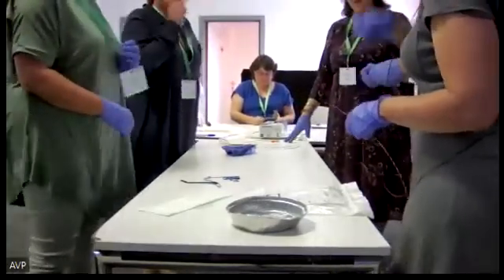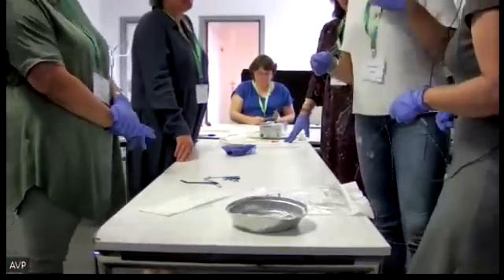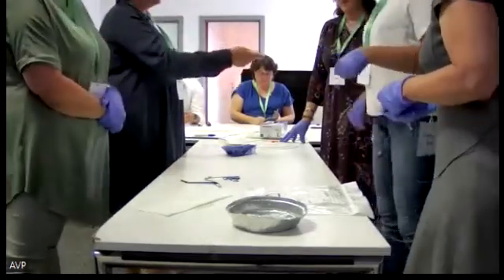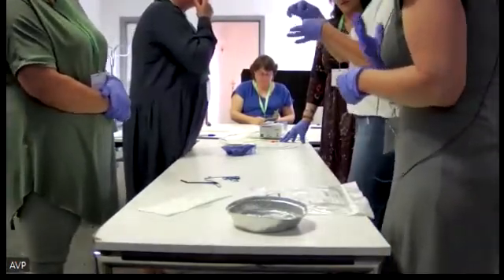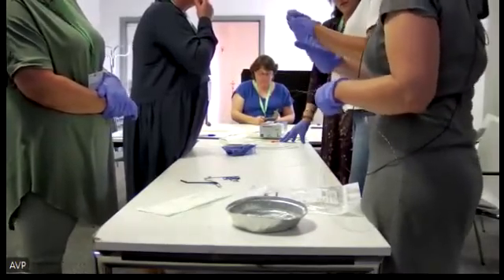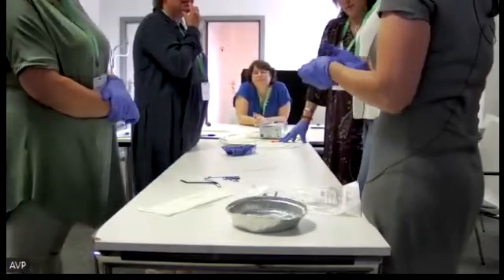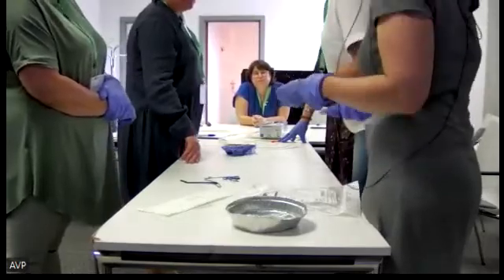First thing I do is take out the locking device. Really? You feel better if you have it in your hands, and you feel that. The locking device goes out or inside. That's the way I work. I block it with my hand. Maybe others have experience with the locking device, but you can live without it. We can also put three or four guide wires in our hands, and I feel that I have better control, but it's also how you learn.